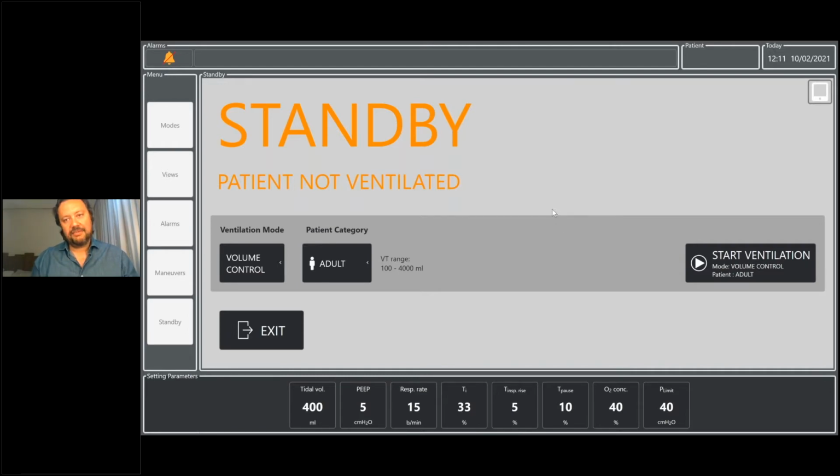You can have them access this software through AnyDesk or through TeamViewer, and then they would be able to adjust the ventilator settings while they are at their home and you are at your office. So you could also use this as remote training software. Okay, so as you see here, it's like a 100% generic, let's say, ventilator. It has all the functions that you need to see.